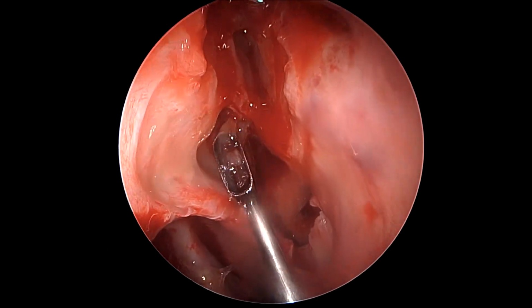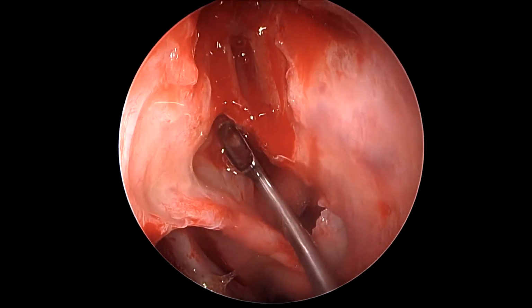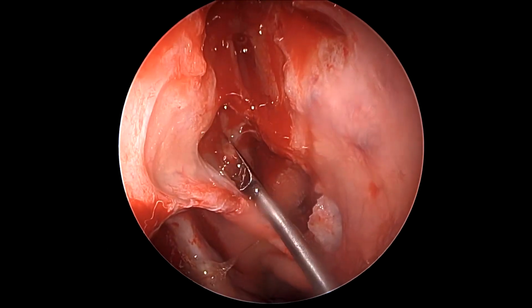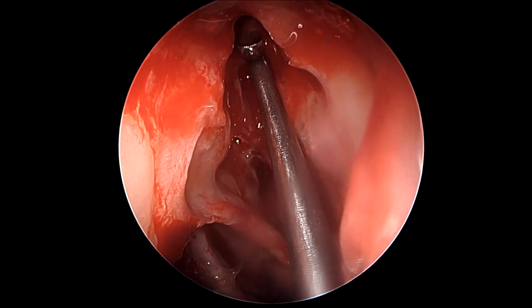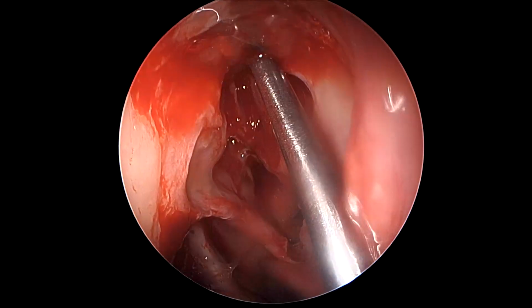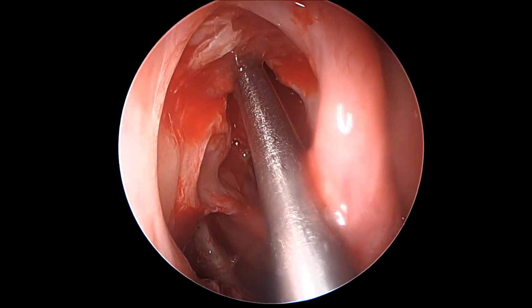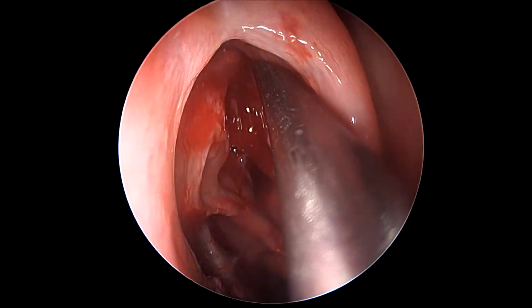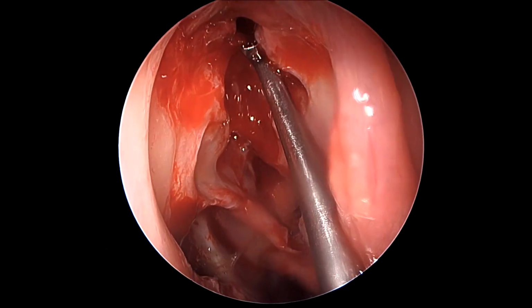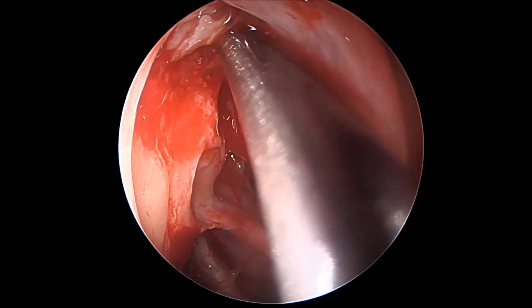In revision surgery, however, scarring and loss of previous landmarks and scar tissue can often lead to illusions, and there is obviously a higher propensity for collateral damage. So as we see here, we are trying to again dissect from posterior to anterior in the frontal recess region, so that we adhere to safety norms and do not penetrate the thin bone of the roof of the nose, that is the cribriform plate.